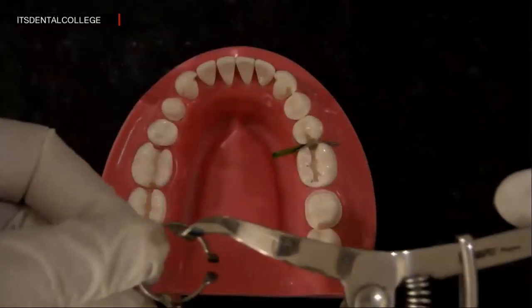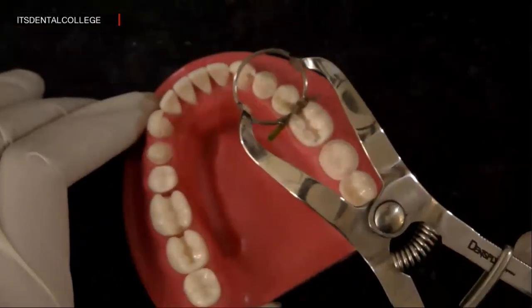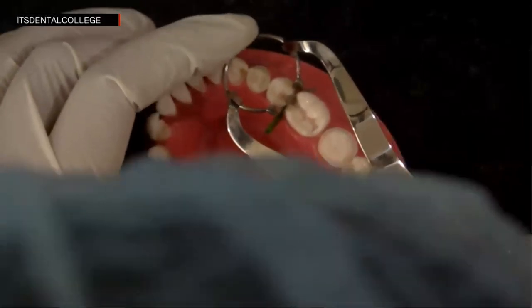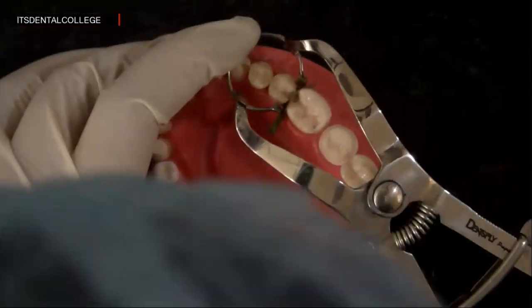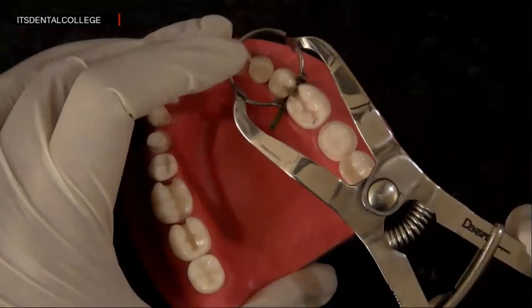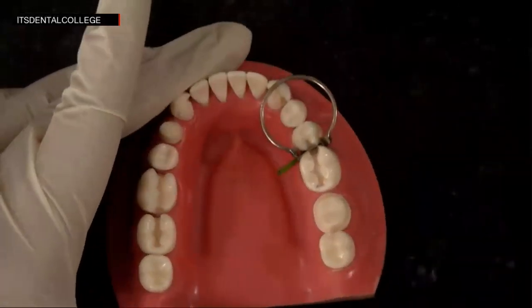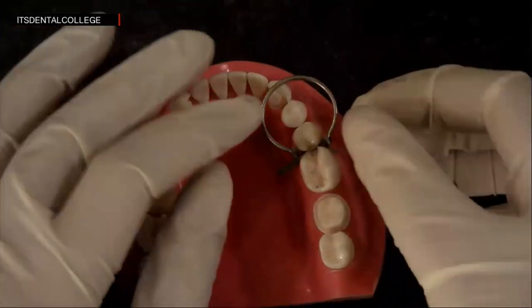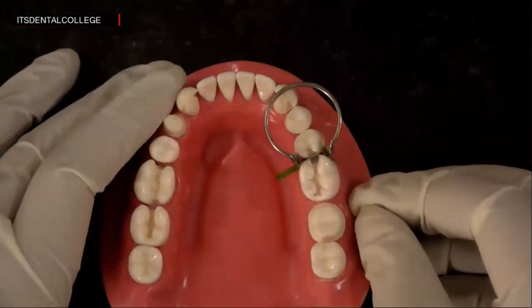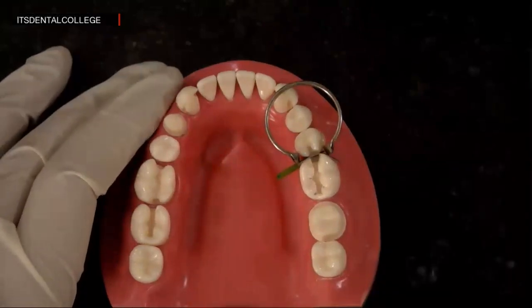So we'll engage the forceps within the ring, and then we'll place it on the tooth interproximally. Okay. This is how the sectional ring would be placed for a class 2 restoration.